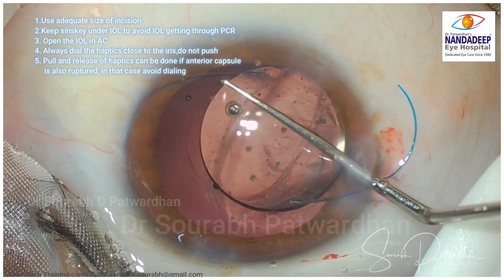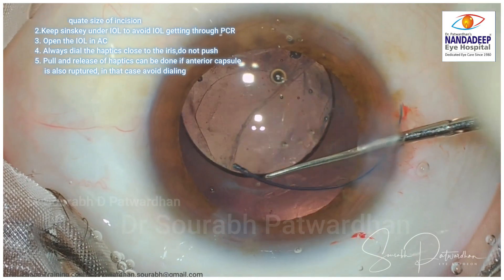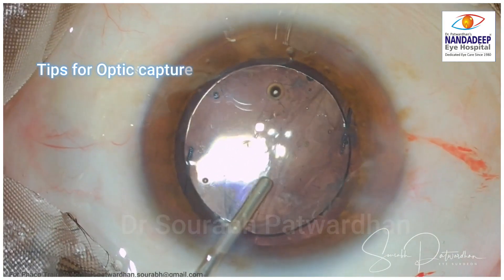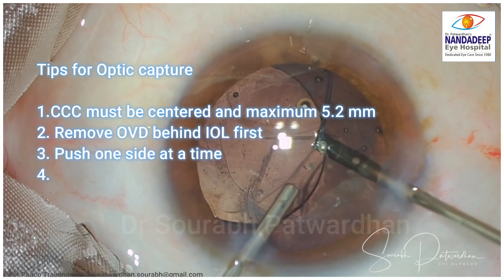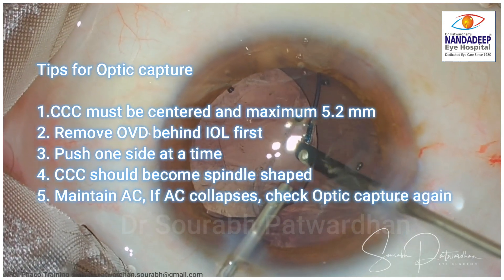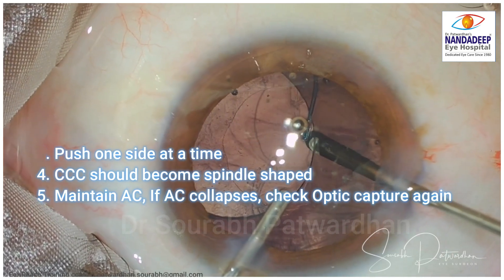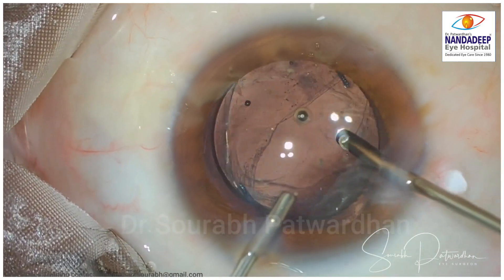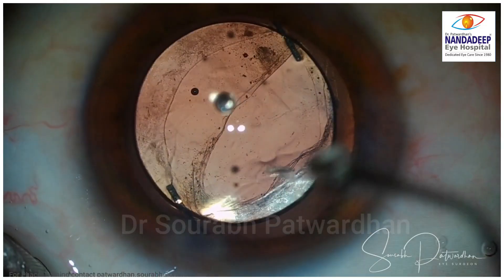Always keep a Sinskey while inserting, open the IOL in the anterior chamber, and then rotate or dial the IOL into the sulcus. If the pupil is small, use iris retractors and make sure everything is done under good visualization. For optic capture, the CCC must be centered and a maximum of 5.2 mm. Remove OVD behind the IOL first, or remove any residual vitreous, then push one side at a time — not from the center. Push one side first, then the second side, and the endpoint is that the CCC should become spindle-shaped, confirming complete optic capture.